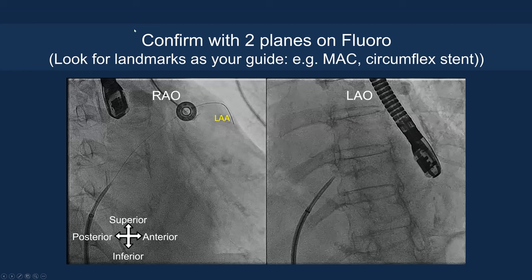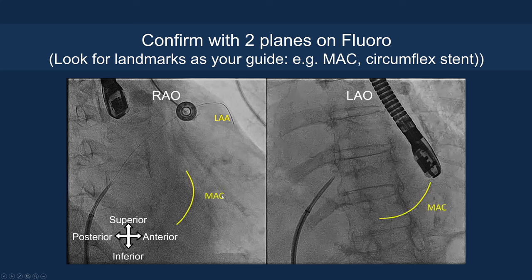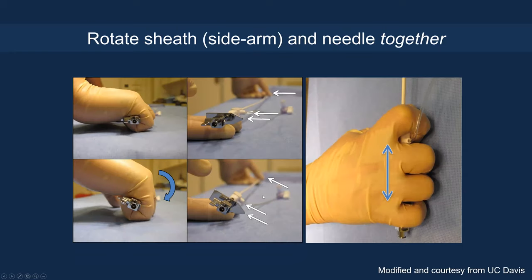Once confirmed, check the fluoroscopic view and look for landmarks such as mitral annular calcification or circumflex stents. You can see superior, inferior, posterior, and anterior on the LAO projection. The left atrial appendage is visible, and you can see where the SafeSept wire has gone — on the LAO view it should be to the left side of the spine, whereas on the RAO view the catheter should be to the right side of the spine as a landmark.